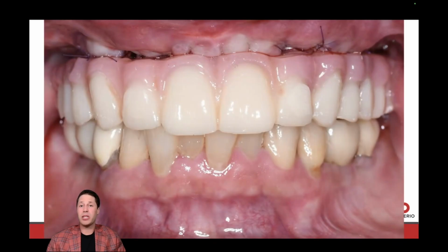This fixed hybrid was placed with 7 implants about 8 months ago. 2 implants were placed in the most distal tuberosity areas on the upper left and the upper right. When it came to the time of stage 2 uncovery, the restoration was removed, and the implant at site number 15 failed. There was sinus proximity in the 3-4 tooth location area and also at the 13-14 tooth location area. So those vital structures were avoided at the time of implant placement to reduce any bone grafting that was needed. So the all-on-X procedure was a graftless solution approach.